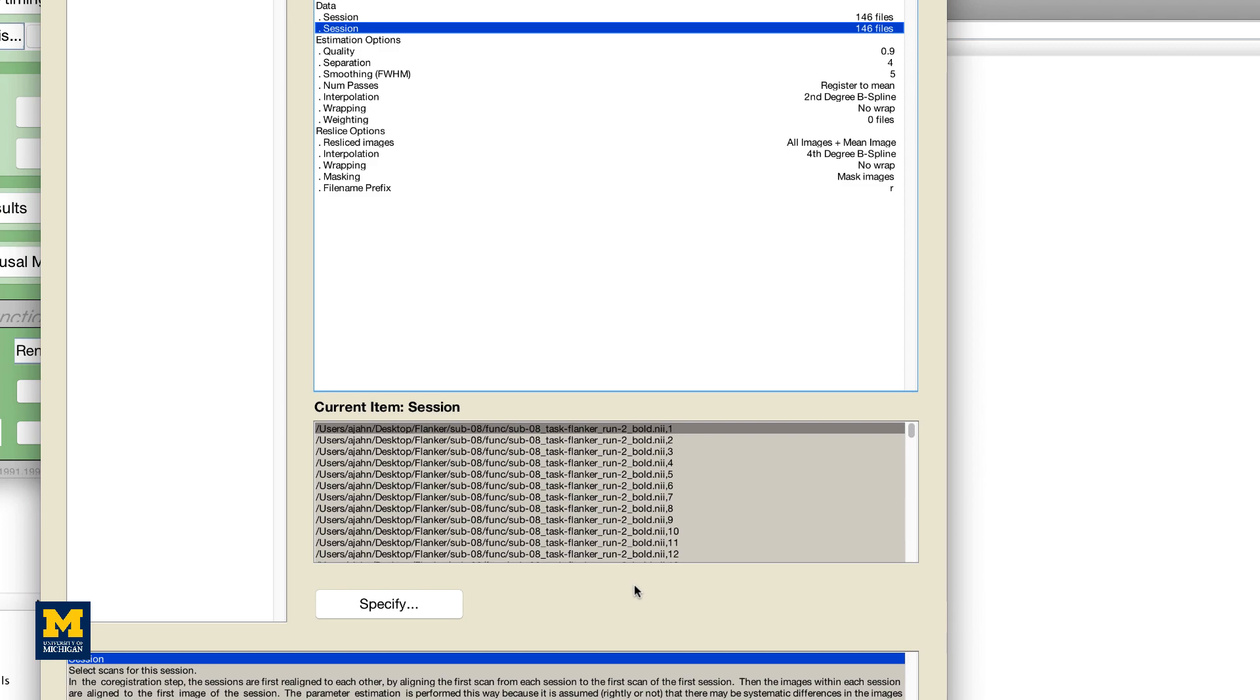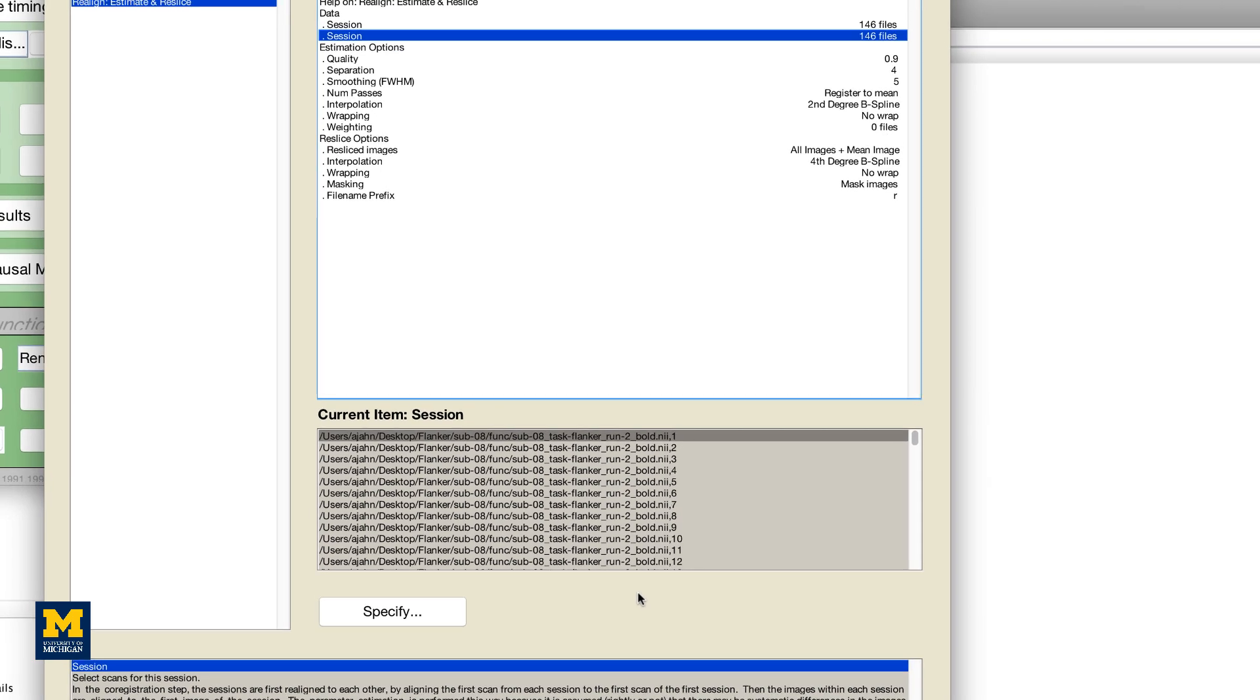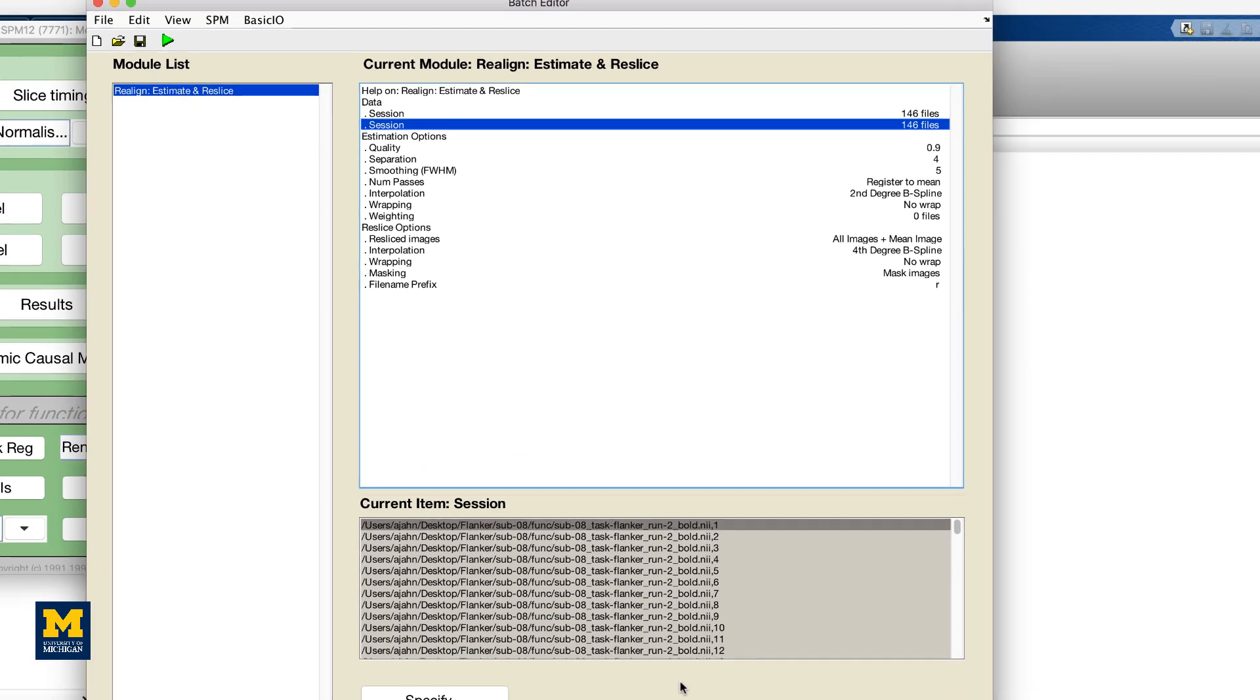Now that you've filled in all of the fields that have an X next to them, the Play button in the top left corner has changed from gray to green. Click on the button to begin the Realignment preprocessing step.